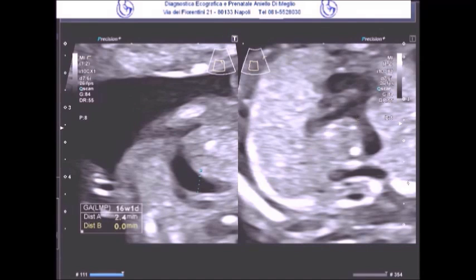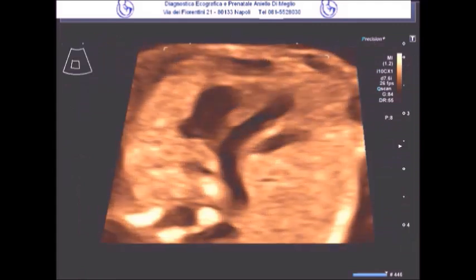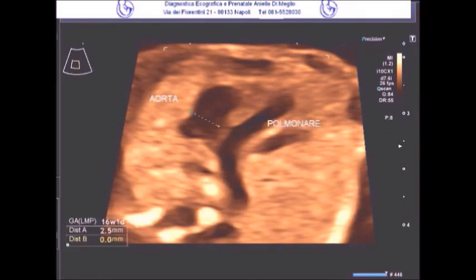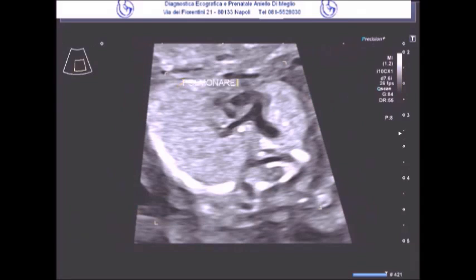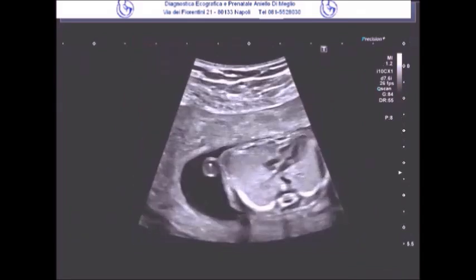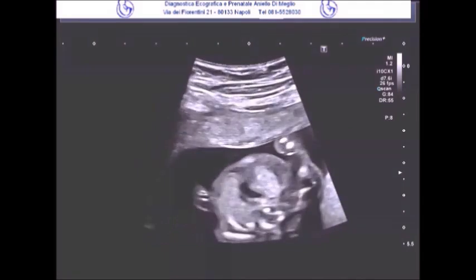severe, but rather mild. In this specific scan, once again, we are carefully evaluating the relationship between the isthmus and the ductus. We are observing this across several different scans to confirm what we previously mentioned. So we can see a very clear predominance of the aorta when compared directly to the pulmonary artery. In this section, we can observe the scan where it bifurcates.